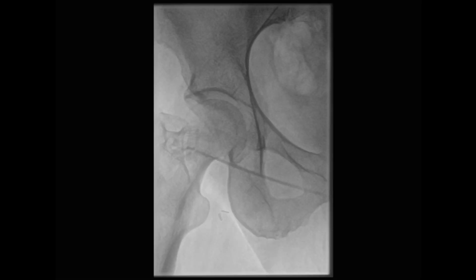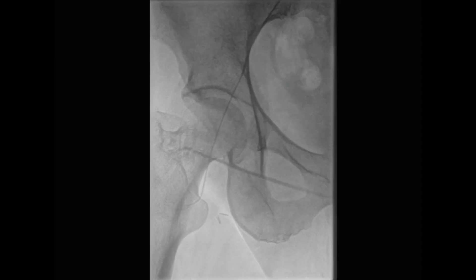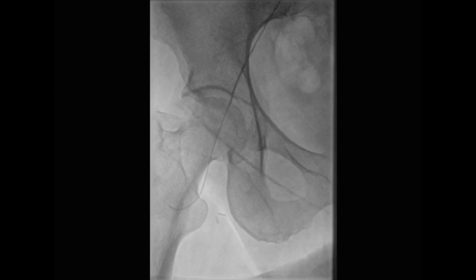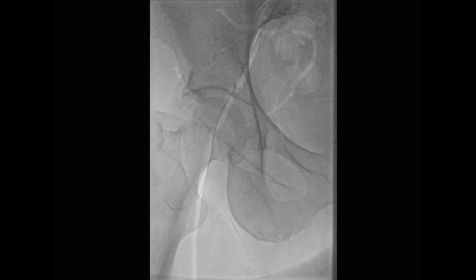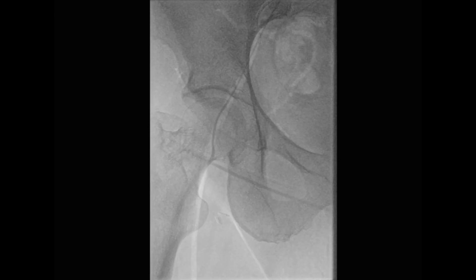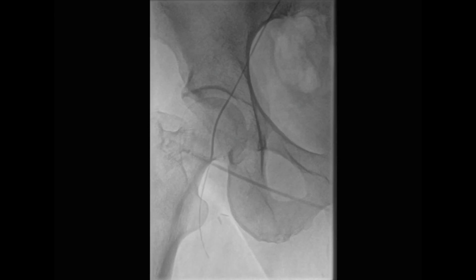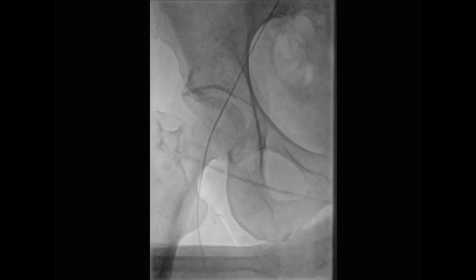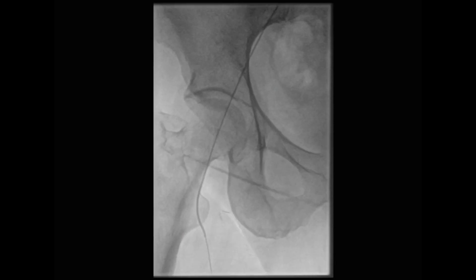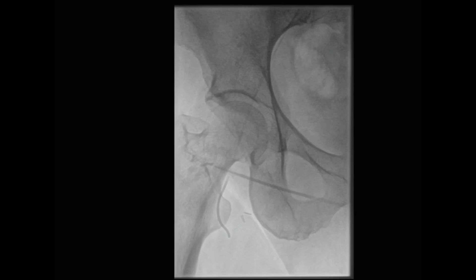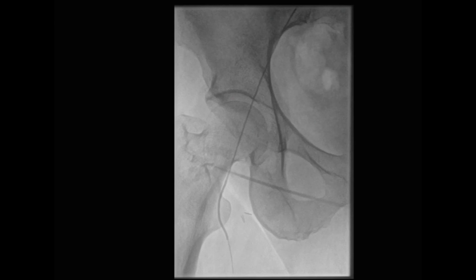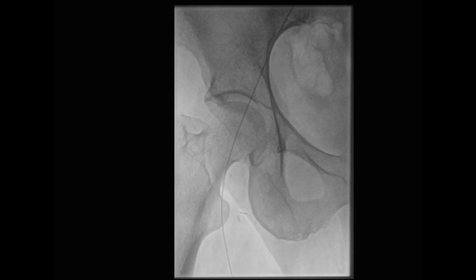We used a soft angled glide wire to cross this high-grade stenosis in the external iliac artery and advanced our wire down through the common femoral artery into the right superficial femoral artery. The catheter was then advanced, and we exchanged over the catheter for a stiff angled glide wire so that we could introduce our 6 French sheath.